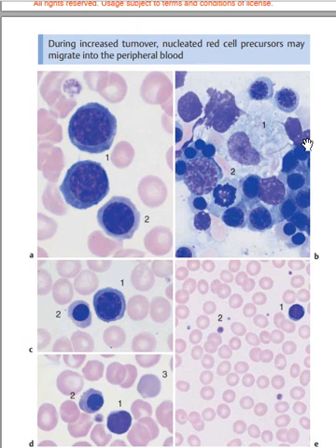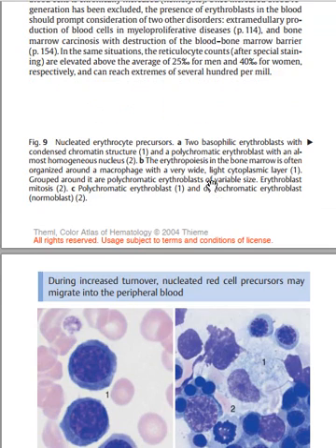Now this is another diagram. In diagram B, you see erythropoiesis is being involved here in the bone marrow, and it is organized around this cell here. This cell is a macrophage. You see how it has a U-shaped nucleus and a very large cytoplasm. This macrophage has erythroblasts close to it. These are the different erythroblasts. This erythroblast can be said to be an orthochromic erythroblast.